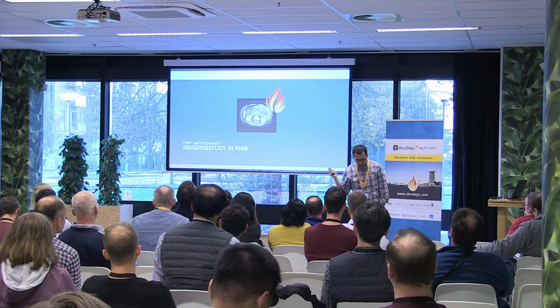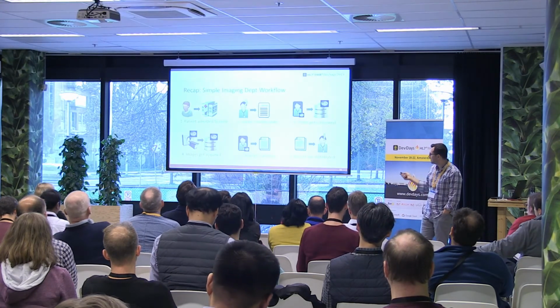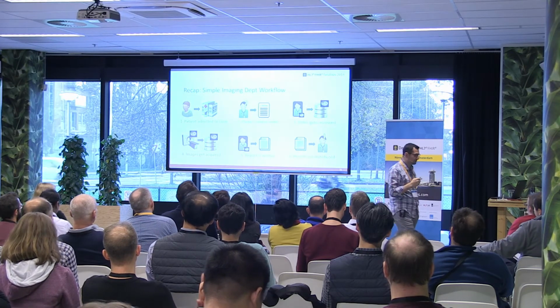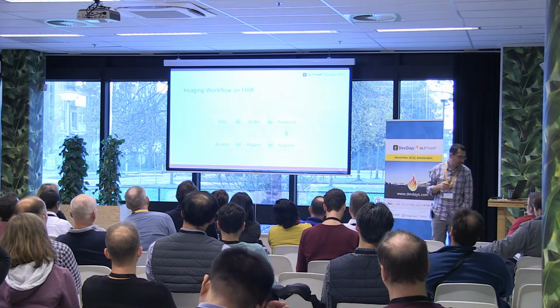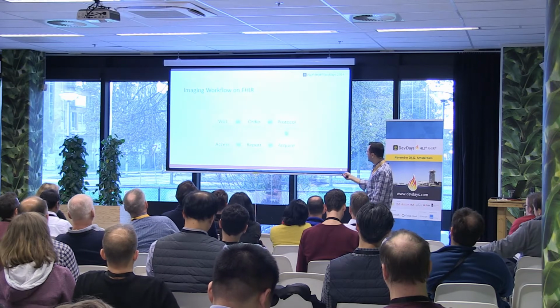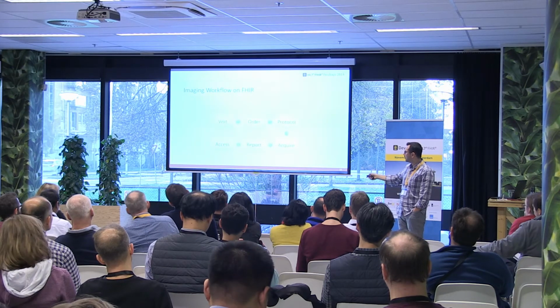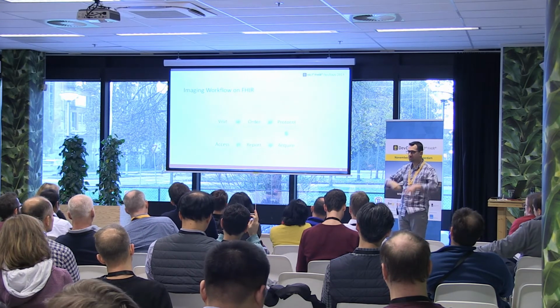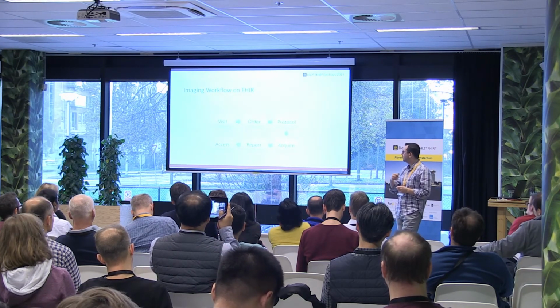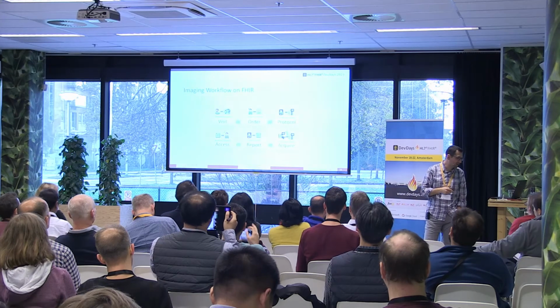Okay, so the intersection between DICOM and FHIR generally happens in the imaging study resource. So revisiting the workflow right here. So if we were to translate that workflow, you've got a visit, which leads to an order. Now the protocol side, let's just leave that aside, and then images are acquired, report is written, and then the report is given away to other people depending on who needs access to it. There's more information.